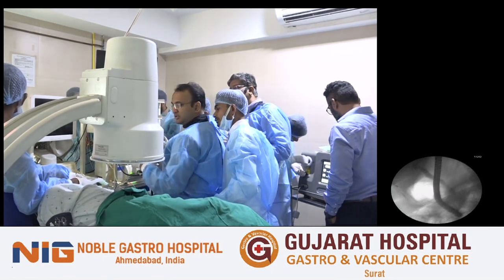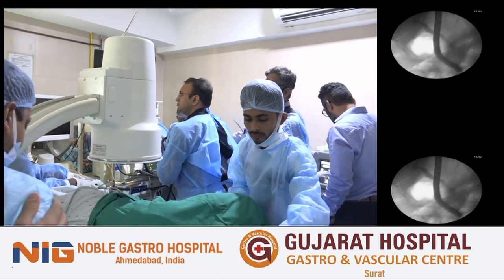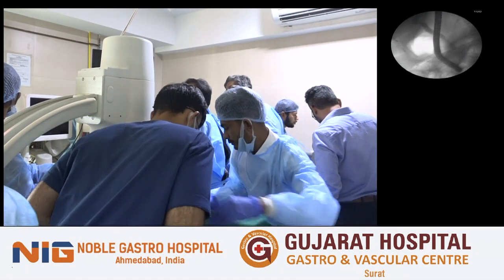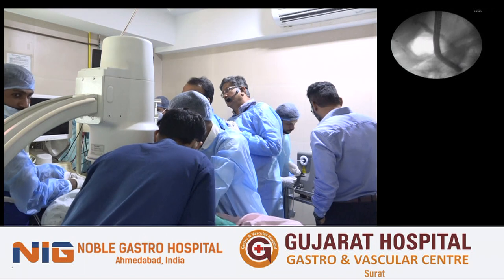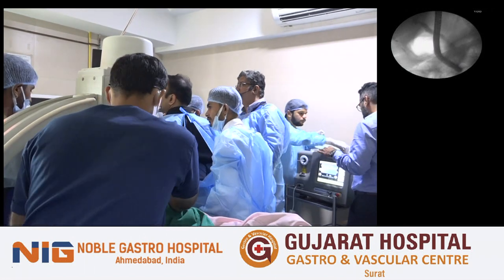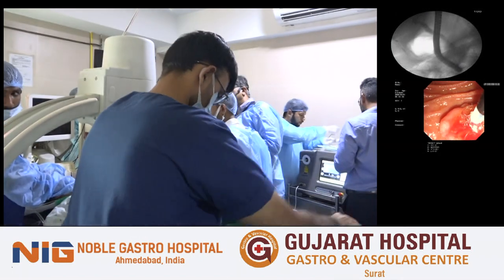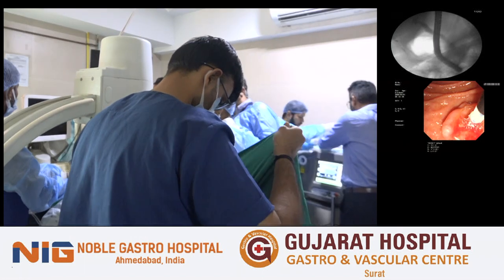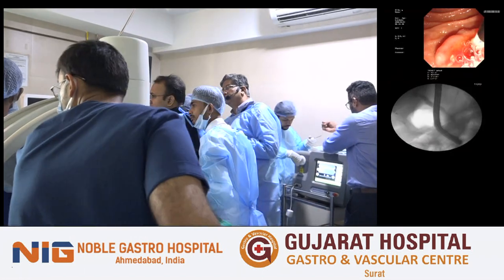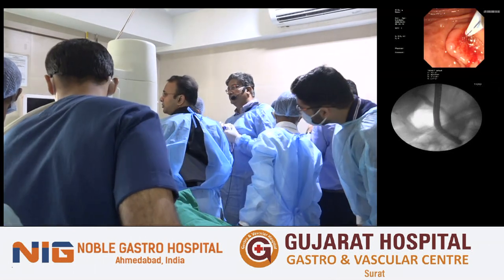When we look at the comparative studies, there is one study which has directly compared SpyGlass versus laparoscopic common bile duct exploration. And this study has beautifully highlighted the overall complications. In group A, that is cholangioscopy with laser lithotripsy, obviously the complication risk is low. And in the laparoscopic CBD exploration, the complication rate is 10%, hemorrhage is 2, and bile leakage is 2. But between these two, it shows that it is a non-inferiority trial.